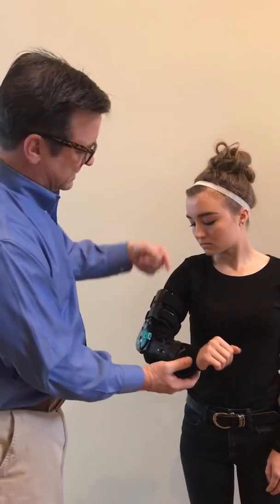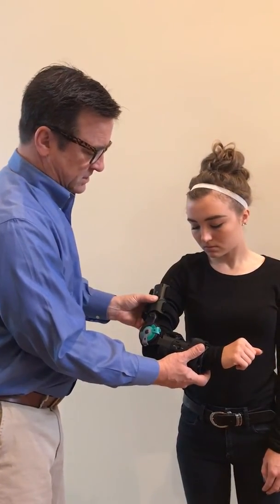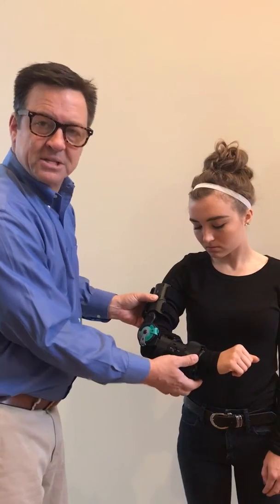It also comes with an arm sling that would attach down low and come up and over your shoulder so that it secures the arm in place. And that's the post-op elbow.